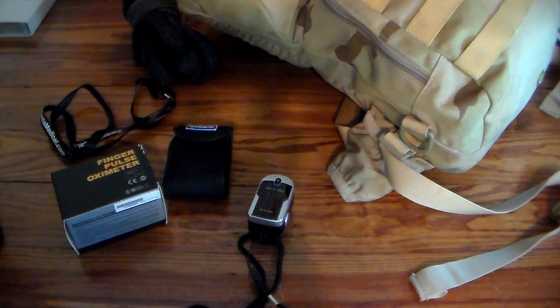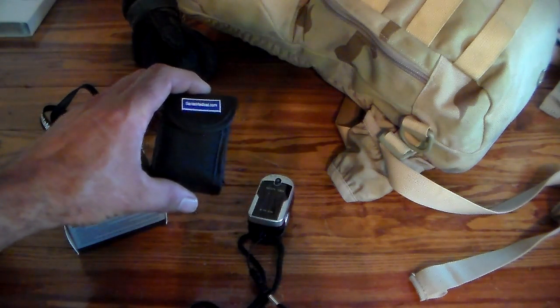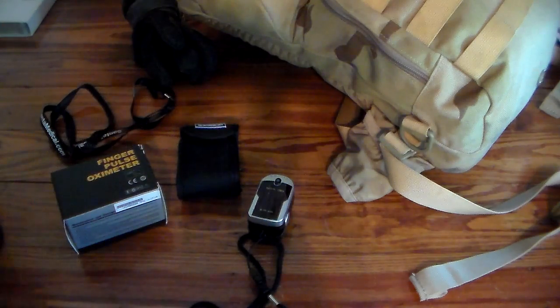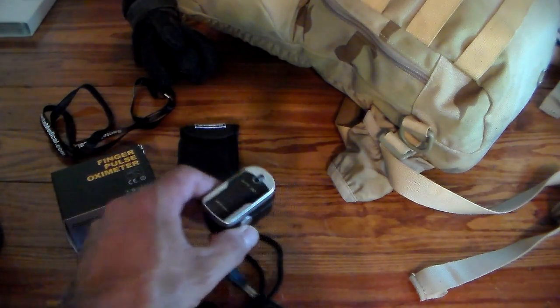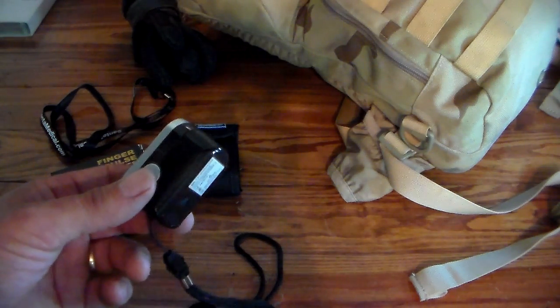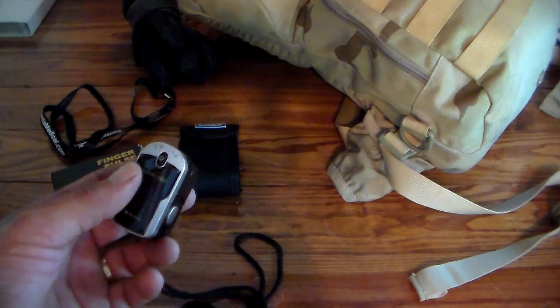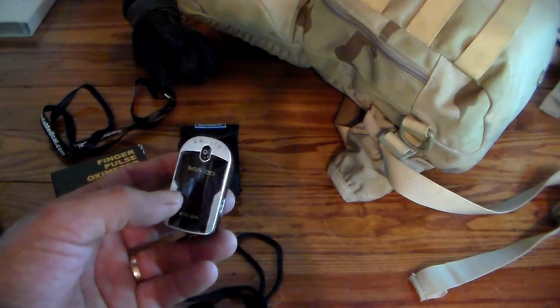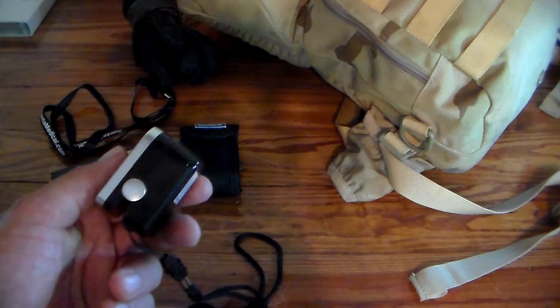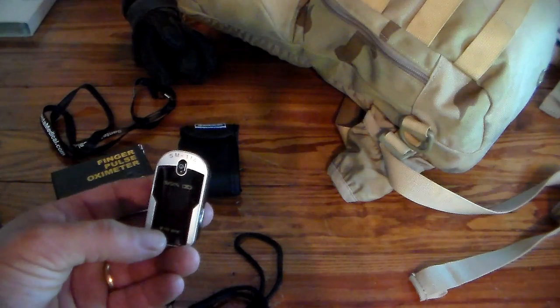So this is a finger pulse oximeter. This particular one comes from Santa Medical. There are a lot of them on the market; they're all basically the same, roughly about $30. I've seen and used them before but I never knew they were that cheap until recently a buddy sent me a link. I said I have to have one of these for my first aid kit, and I went ahead and bought two — and since then I've bought two more on order.